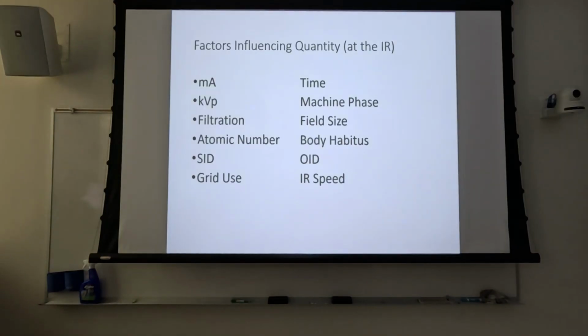The science behind the reason why we use mAs instead of kVp is still valid. If we increase our kVp, we have an exponential increase in scatter radiation. And before we had digital processing, there was a direct correlation to the contrast that we saw in the image, and we just don't see that so much anymore.